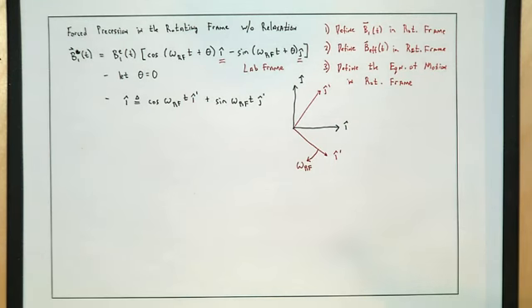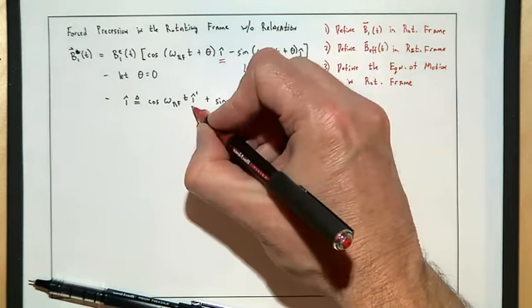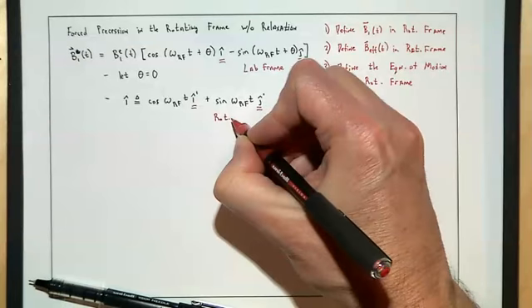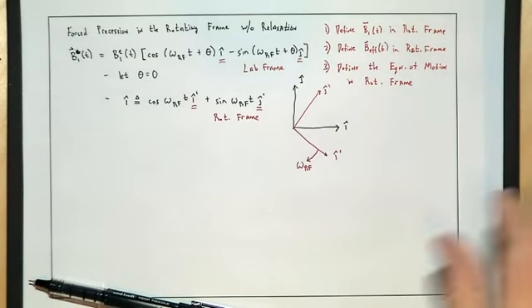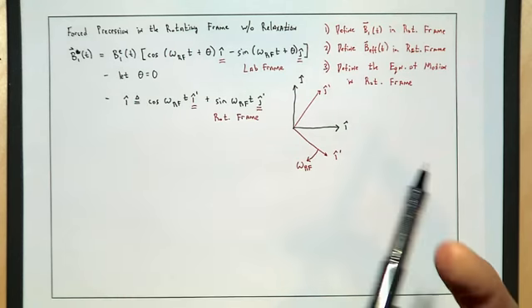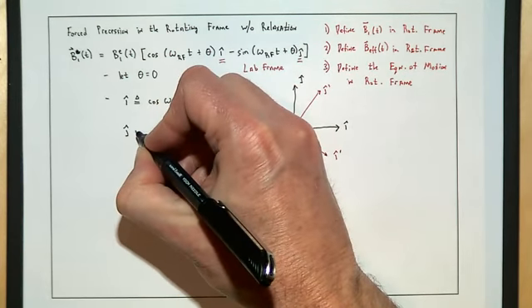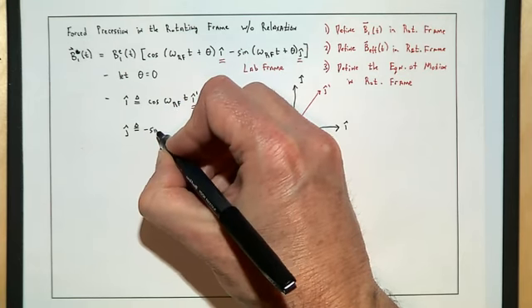So the relationship between those two coordinate systems, here we can see the rotating frame and its relationship to the I component of the laboratory frame. We need to do the same thing for the J direction. These are just by definition. So we'll define the J direction, and it looks a lot like those other rotation matrices.